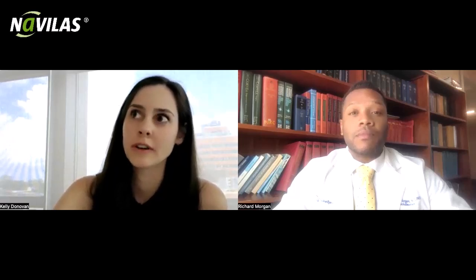I think the highlight of the Navilas is that it's fast. Yeah, I've definitely found that to be true, especially for patient positioning. I think in general, it's more comfortable. And then the converse of that is there are definitely some patients who are not as well suited for getting treatment with Navilas, and then we fall back on our more traditional lasers, the indirect or the direct laser. And I think it's important absolutely for residents and trainees to know how to do those lasers as well.